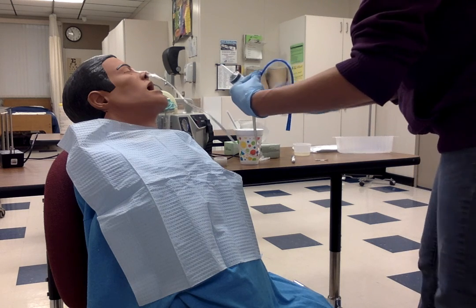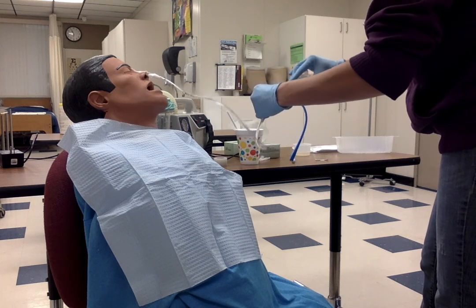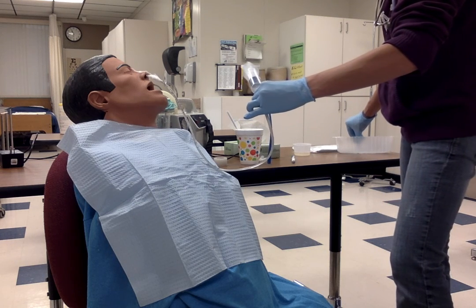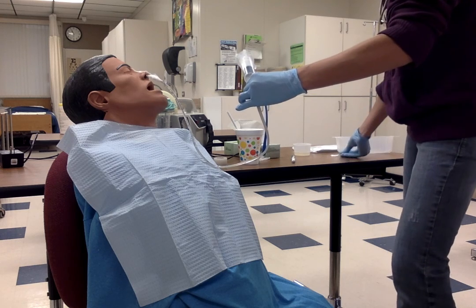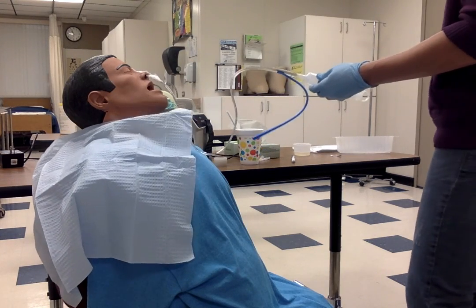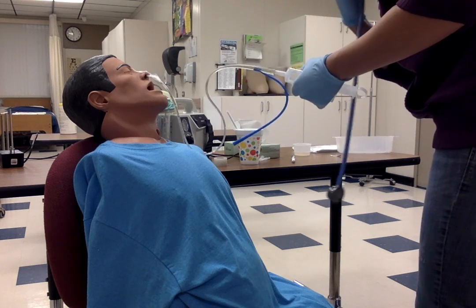Okay, now I'm going to aspirate back 30 and I'm going to put this again in the clear tubing. Now, my pH needs to be tested. So I'm going to use my pH strip, and I'm going to test that. And we'll let that sit for a second. Now I'm going to check for placement. So I'm going to be putting this 30 milliliters of air, and I'm going to listen with my stethoscope to see if I can hear a swooshing sound.